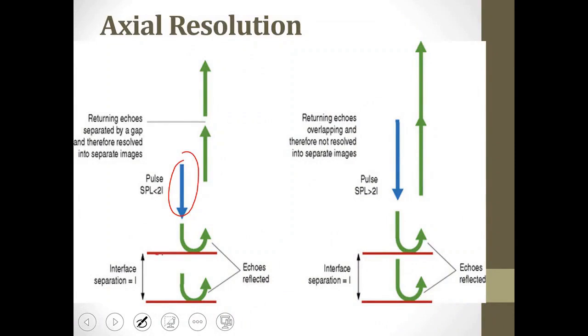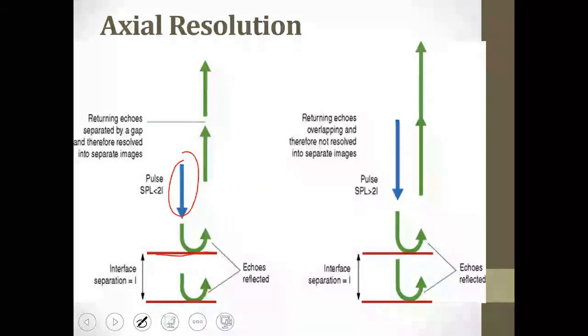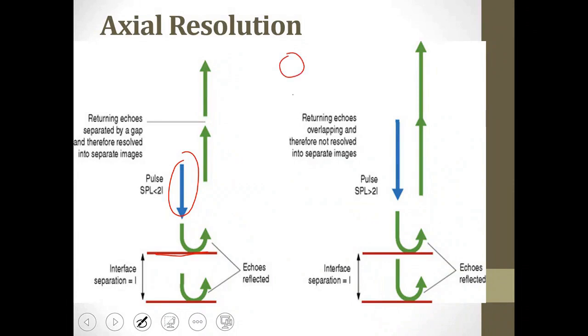This pulse has reflected from the first interface or the first object and returned. There is a part that reached the second reflector and returned. Focus with me like this. If the distance between the two is large, I don't have a bigger problem.